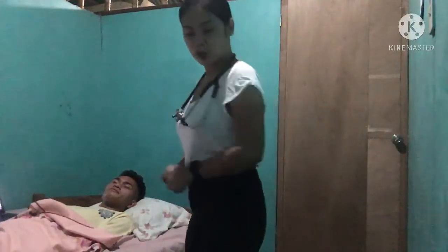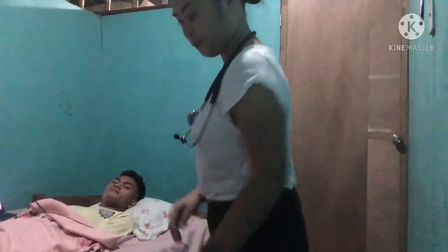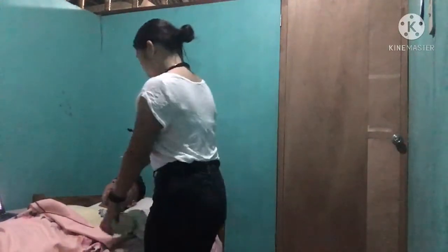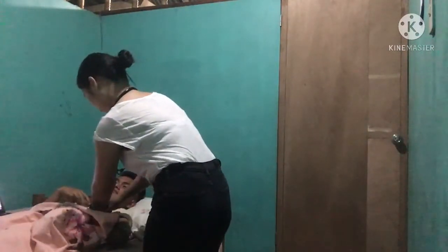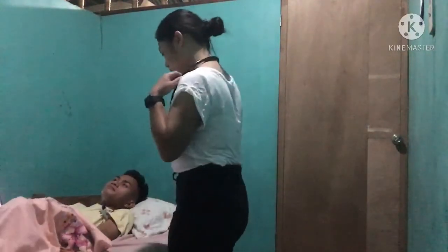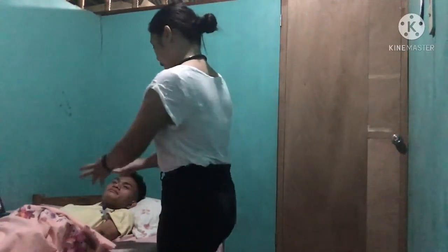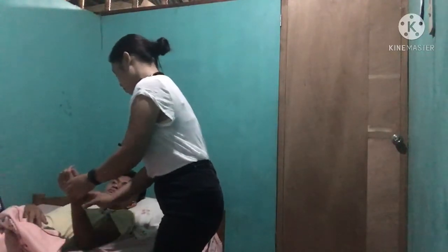Okay, sir. So first, I'm going to take your temperature. So kindly put it under your armpit. Okay. I'll just assist you. So while waiting for your temperature, I'm going to take your pulse rate. Can I have your hands, sir? Your hand here. Okay. Thank you.